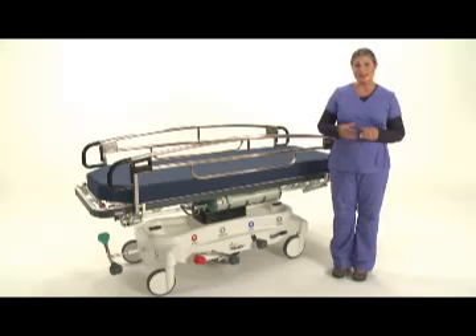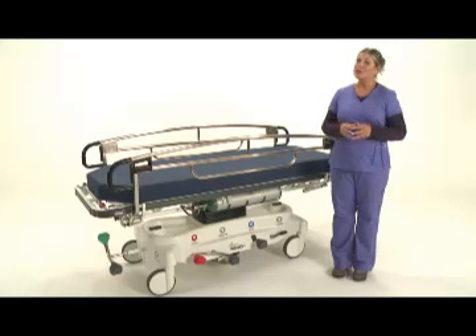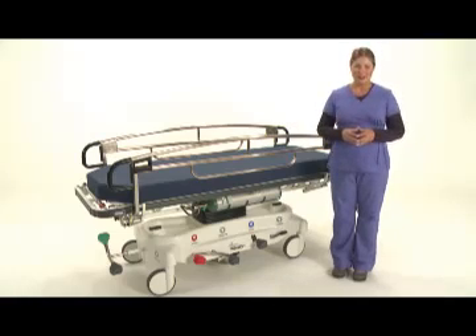Hi, I'm Jill with Pedego Products and this is our 7500 series trauma transport stretcher. I'm going to walk you through a number of features that set this stretcher apart from others in the industry.